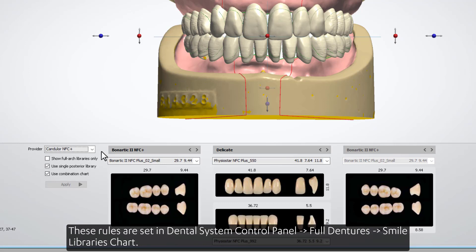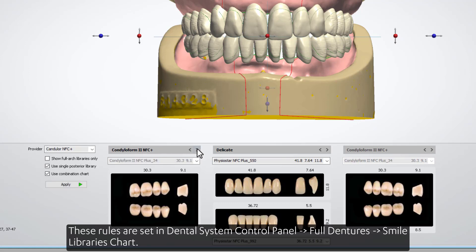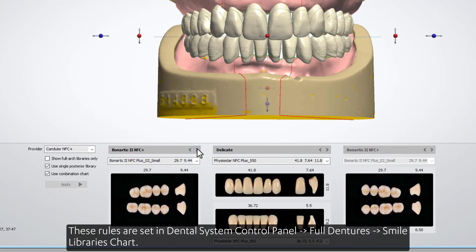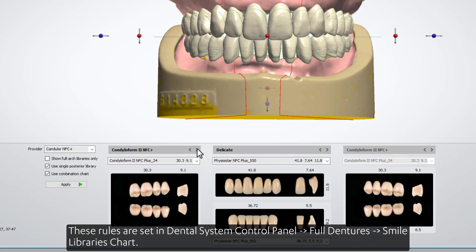These rules are set in Dental System Control Panel, Full Dentures, Smile Libraries Chart.